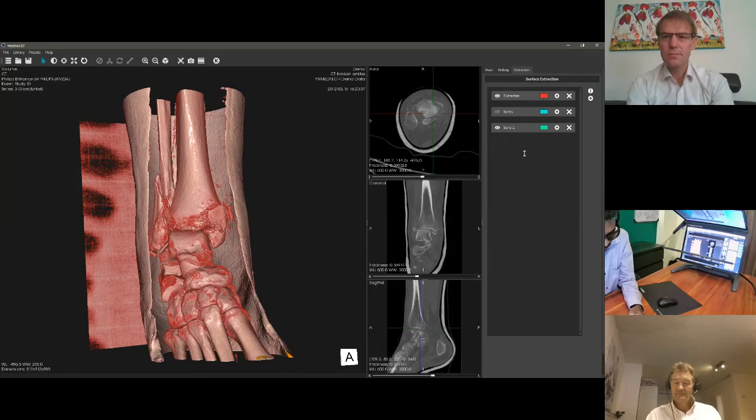What Arjen was saying, that we also have a patient version available for Visualisation 3D, is because we get a lot of questions. And the questions are always, I don't understand what's wrong with me, and I want to understand it. I have to explain it to other people. But that's also the same question that a lot of medical professionals have.